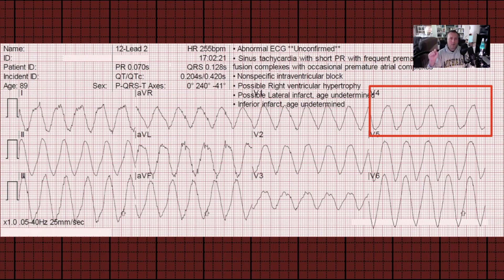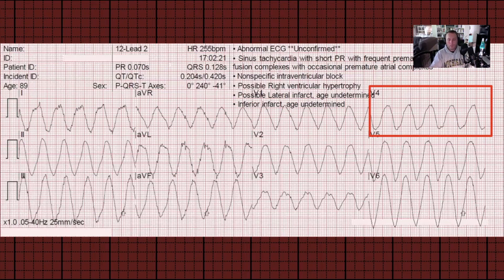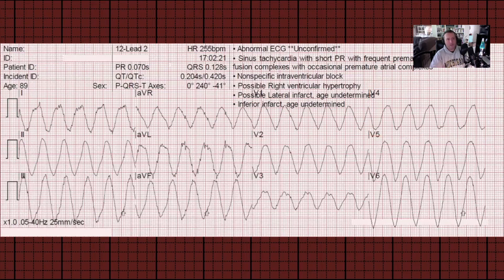This is actually life-threatening hyperkalemia. Had the paramedics known about the large block method, they would have realized this was not VTAC because the heart rate is only around 120–125. Is it possible VTAC could have a rate of 125? It's possible — this has been referred to as slow VT — but we really need to think about an electrolyte derangement in this case. Rather than synchronized cardioversion or amiodarone, what a patient like this actually needs is calcium gluconate or calcium chloride to stabilize the transmembrane potential, which could be life-saving.